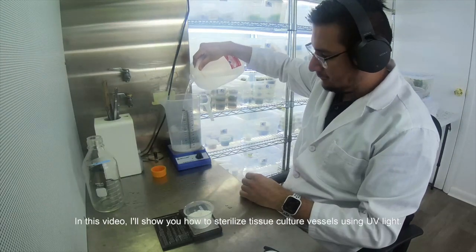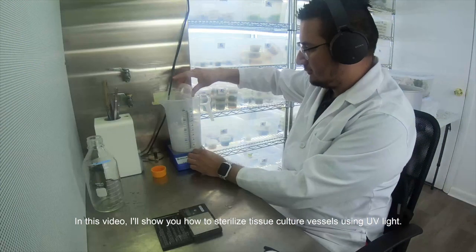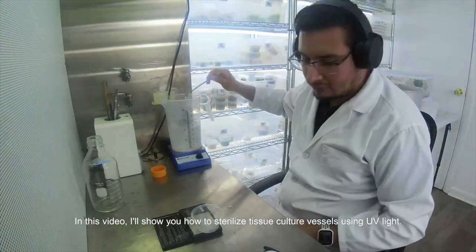What is going on guys. In this video I will show you how to sterilize T-shop Kortul vessels using UV light.